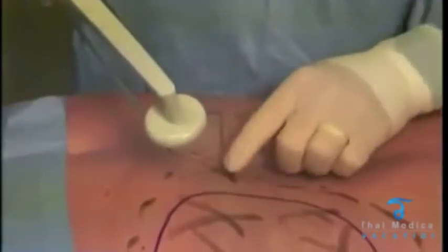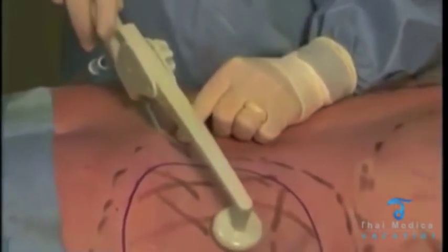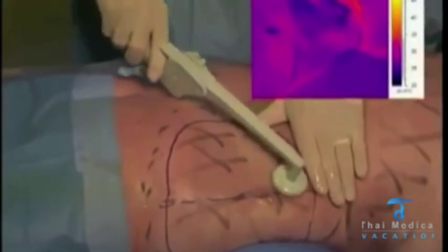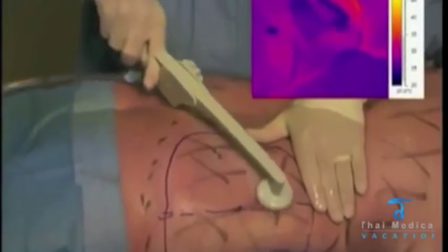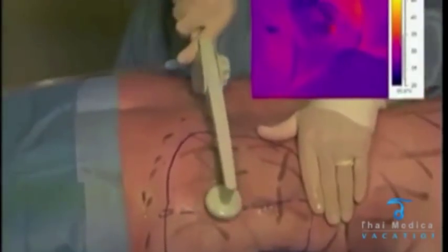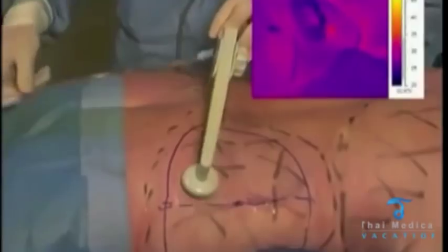We're going to go into our proximal port here. You can hear the Body Tight machine — a nice audible tone so you know that you're nowhere near your cutoff temperature. I'm making nice even passes in the tissue, starting at about 26 degrees, making a fan-shaped pattern through the tissue.